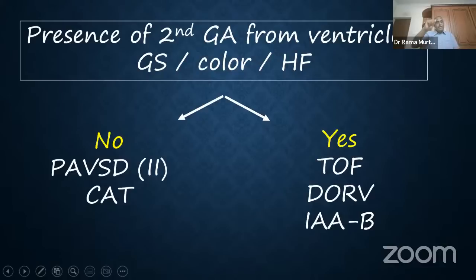Let me go up and down. Let me go from 4-chamber view to LVOT. Let me go to the RVOT. Let me move to the 5-chamber view. So use your rotational skills and your up and down, translatory movement to see if there's a second great artery.